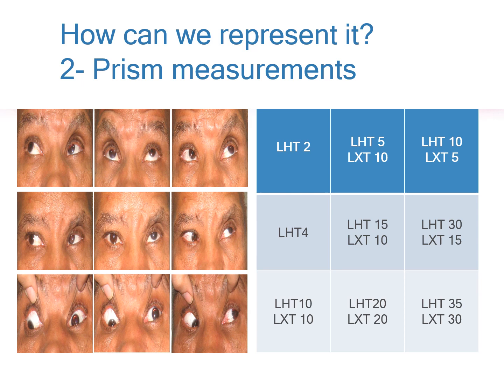Another way, we can measure the angle more accurately using an objective method like the prism and cover test, and again plot the measured angle in each of the 9 diagnostic positions. Again, you can see that the largest deviation is in the down and left gaze, suggesting a problem in the left inferior rectus muscle.